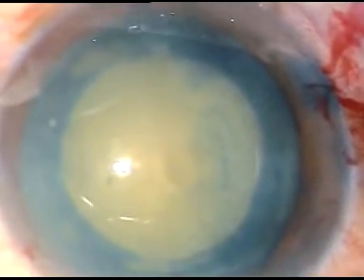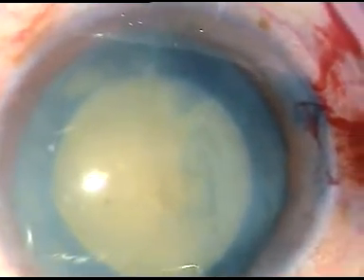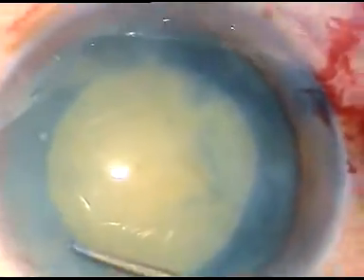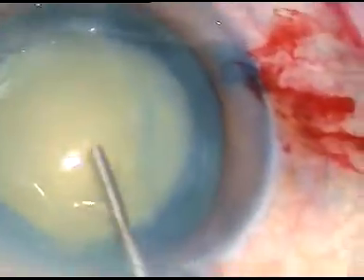Hydrodissection is usually not required. But since this is a non-intimescent cataract, I did a little bit of hydrodissection.